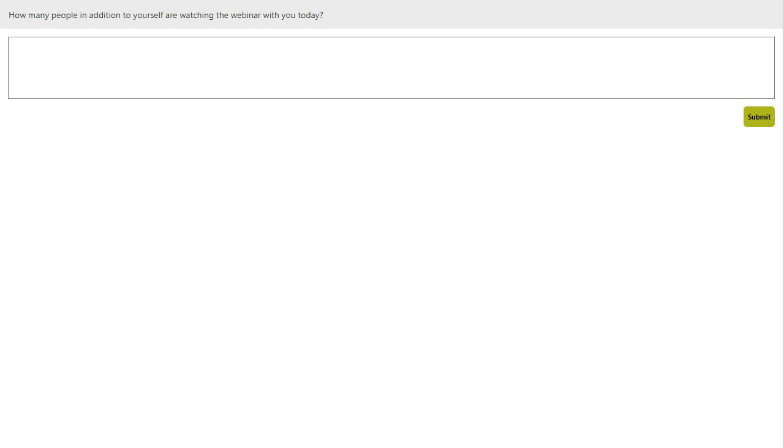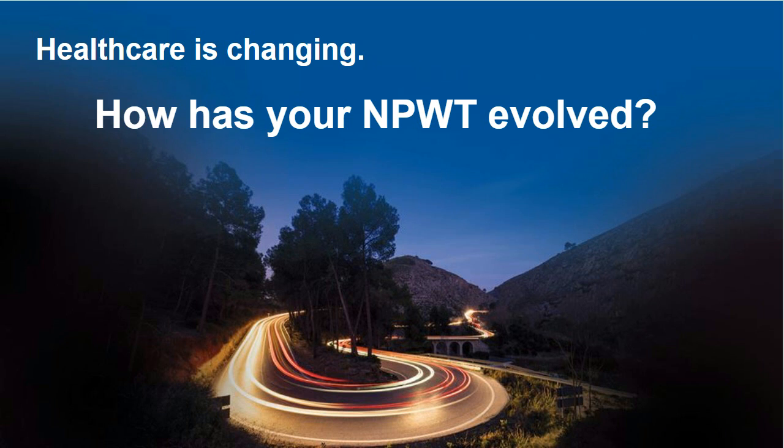Well, we don't ever want to apply the dressing circumferentially on the lower limb. There's so much swelling and so many changes in the fluid situation that it could actually cause more pressure and start sort of like a tourniquet effect. So for that reason, we don't ever want to put the film and the adhesive circumferentially on a lower limb. Hope that makes sense.